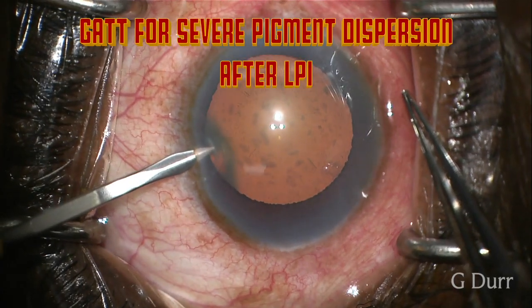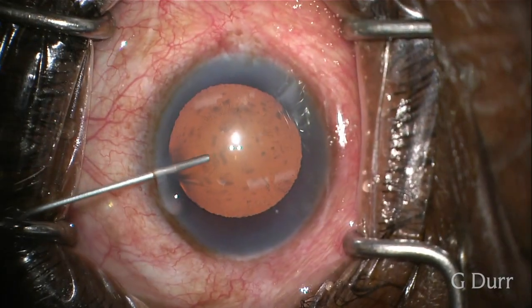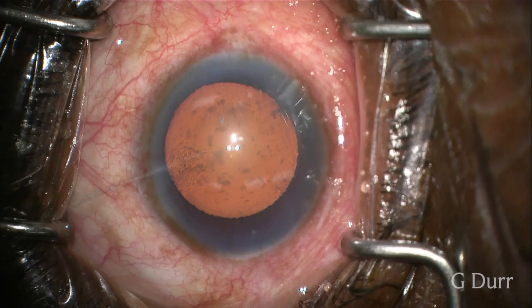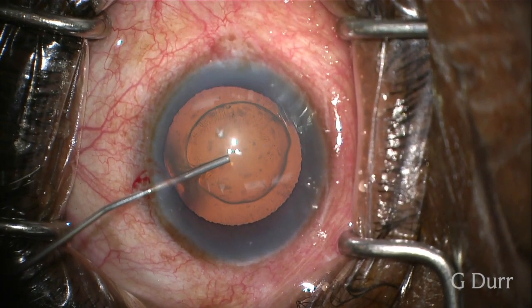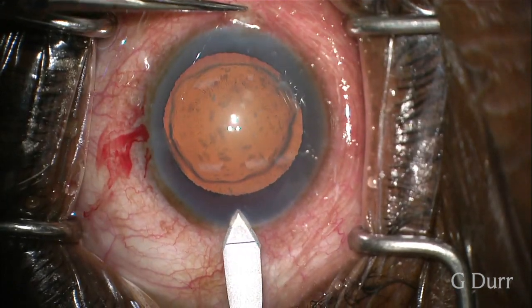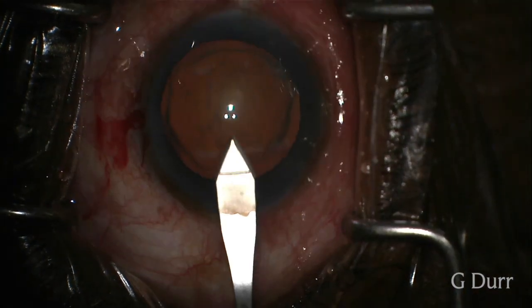In this video, we'll be showing GATT for severe pigment dispersion after a laser peripheral iridotomy. The patient had the laser done about a month ago for a suspicion of a narrow angle by a referring physician, and pressures were riding in the mid to high 30s despite maximal medical treatment and oral acetazolamide.